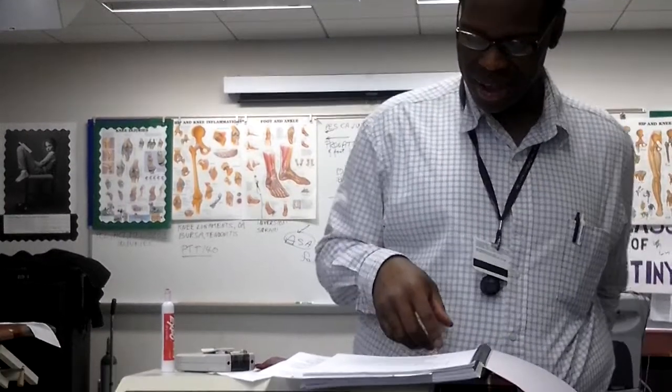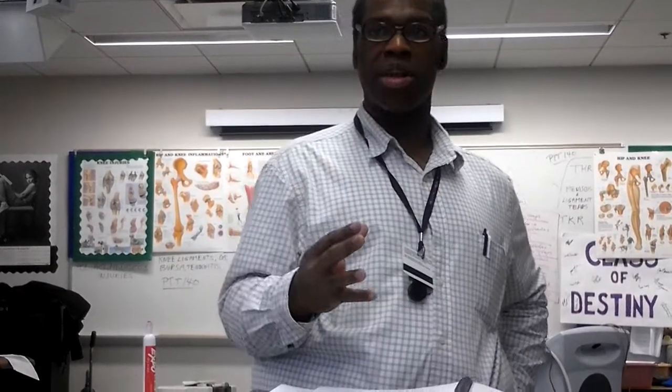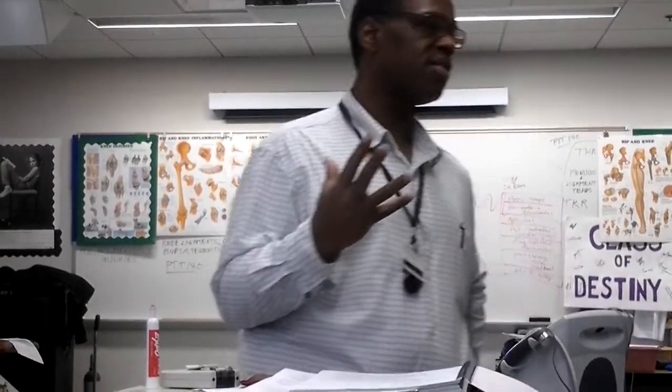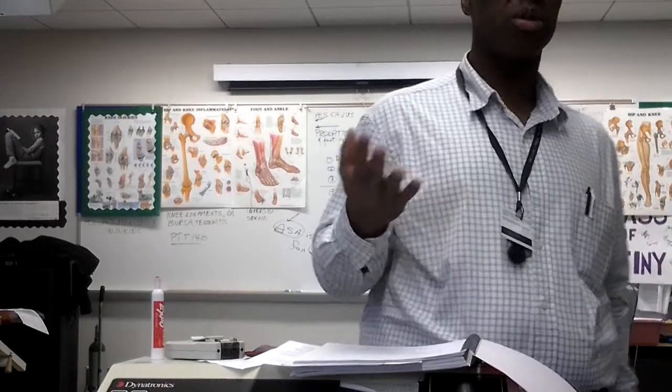All right, so beta endorphins produce. Let's see, B3 at the bottom. Produced primarily in the anterior pituitary, stimulates the A delta and C pain fibers via twitch muscle contraction. Parameters are low, so here's the low rate TENS. In order to release the beta endorphins, we need a chronic pain protocol, which is 1 to 5 pulses per second, moderately long pulse width, which is greater than 200, so we can do 250 or whatever, microsecond.